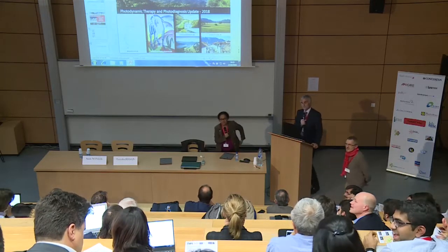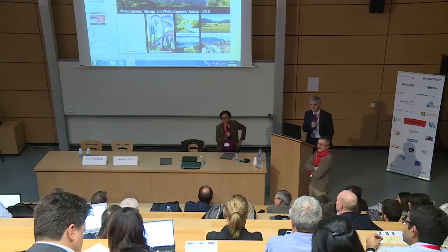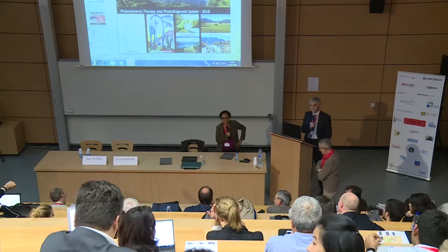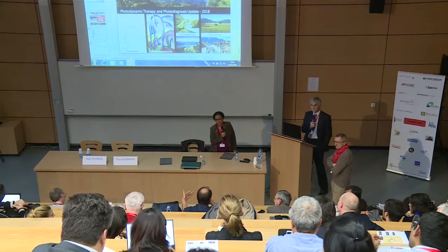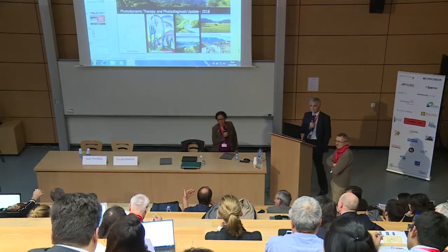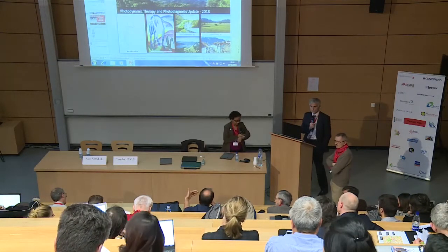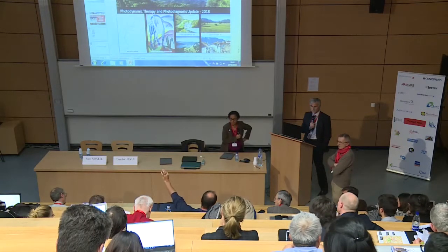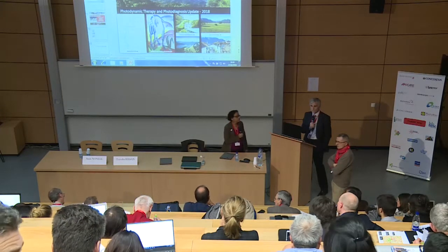Okay, yes. I see we think along the same lines for a lot of the dosimetry, and thank you for mentioning our work in Lothar's group. One big difference I see from radiotherapy is that we are imaging with X-rays and treating with X-rays, so we have pretty good certainty over the transmission properties, and we don't have that in optical means. I don't really have a good answer for this, but how could we take account of that when we present the plan? The dose volume histogram is a line, but there's some significant uncertainty in that, I think. I'm wondering what your thoughts are.